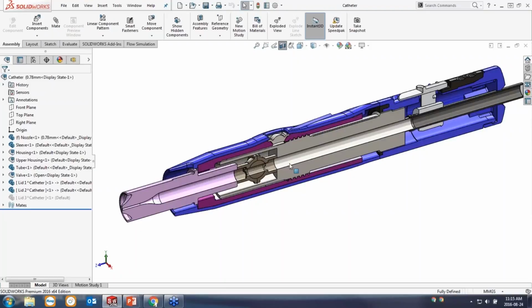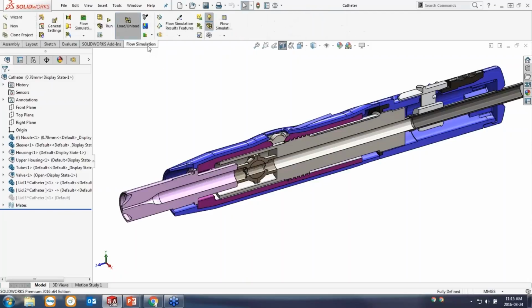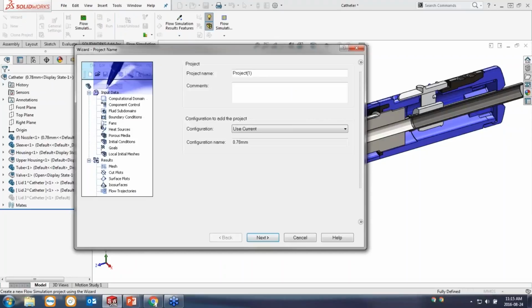So let's start this from scratch. We've got our flow simulation add-in enabled, and we're going to go and start a new project. Now I can do this manually, but there is also a wizard available, and the flow simulation wizard is very useful. In fact, I use it every single time that I start a new project. I know a lot of softwares have wizards that are very hand-holdy and slow. This is not one of them, so I'm going to go ahead and grab that wizard. We'll start a brand new project, and I can give this a name. Maybe we'll call this my test 1.